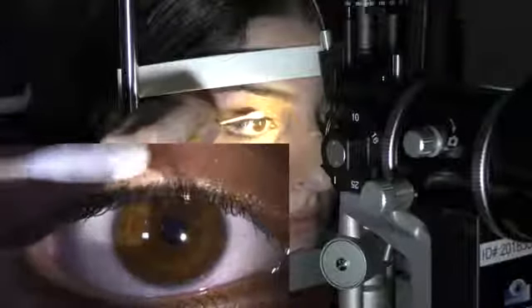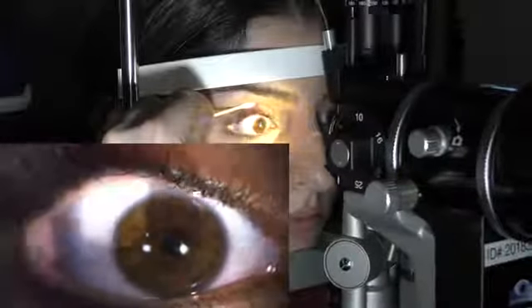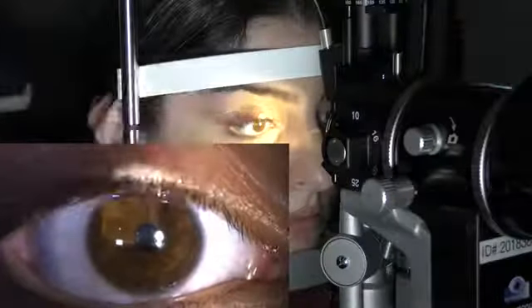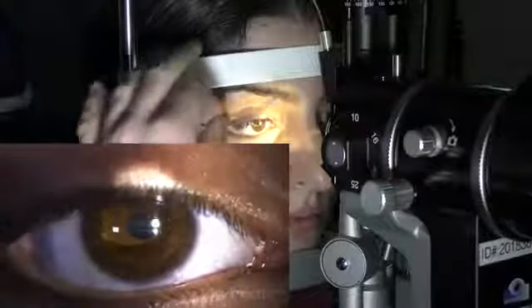Now look straight ahead. Good. And now what you can also do is lift the eyelid and look across. Again, look at the same structures. What I like to do too, if I'm worried about a cornea foreign body, any trauma to the eye, I like to invert the upper eyelid and look for any foreign body there, any follicles again, any papillae, so we can do that as well.